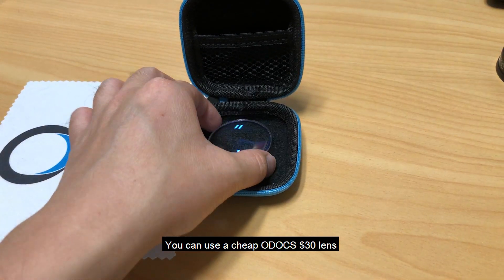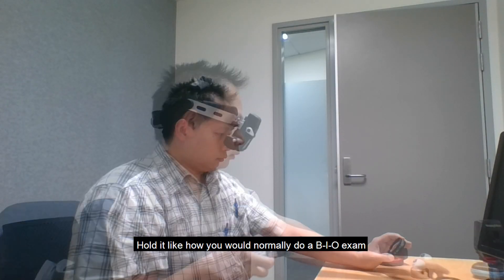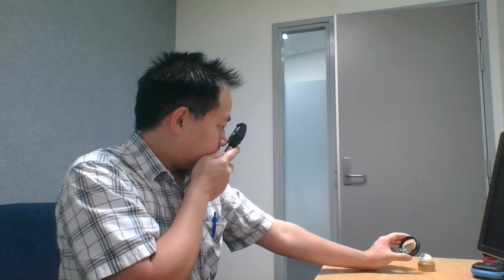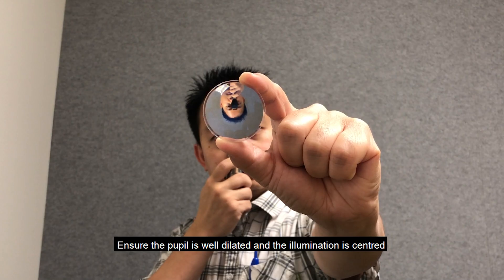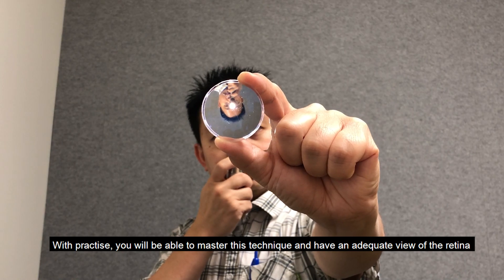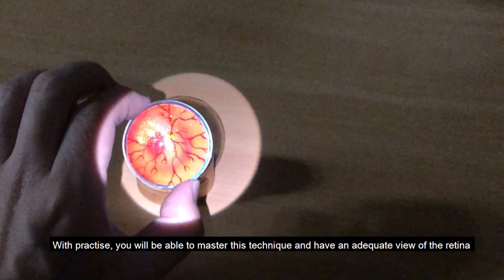You can use a cheap O-Docs $30 lens. Hold it like how you would normally do a BIO exam. Ensure the pupil is well dilated and the illumination is centred. With practice, you'll be able to master this technique and have an adequate view of the retina.